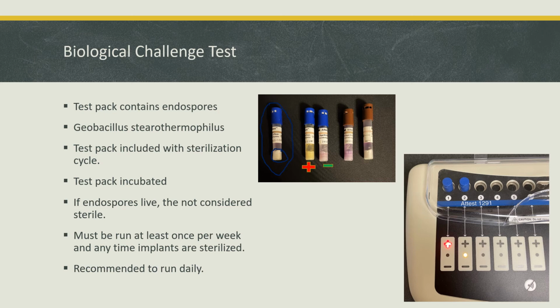And then anytime that we are sterilizing implants. Now, once it is complete, we let this cool.